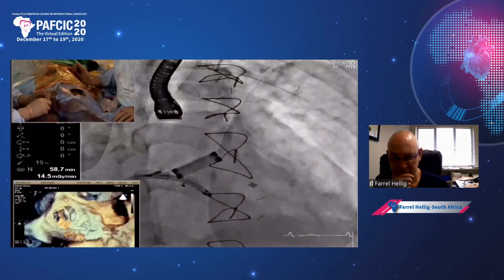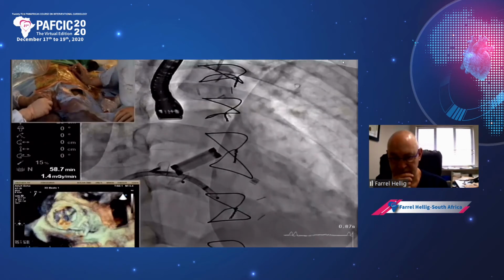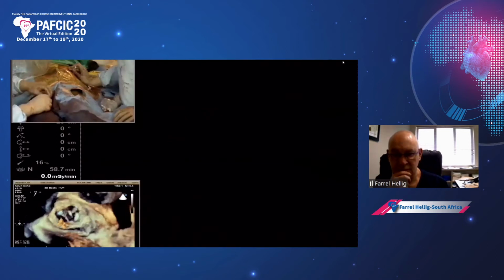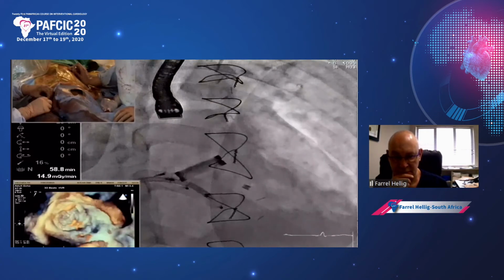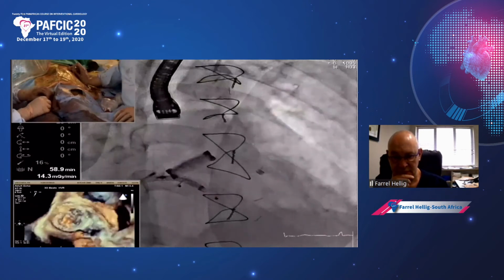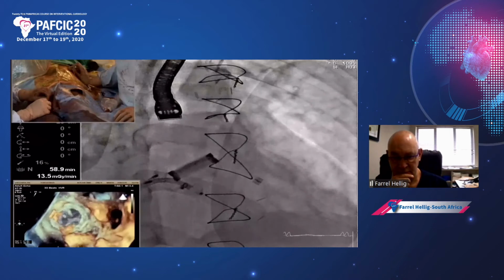Okay, you can fluoro this. Okay, right. Ready to pull back? Okay. Just have to watch the other device. And this one's right near the disc hinge point, so we'll watch the valve disc as well. Screen. Huge amount of resistance to retraction of this. Just going slowly.